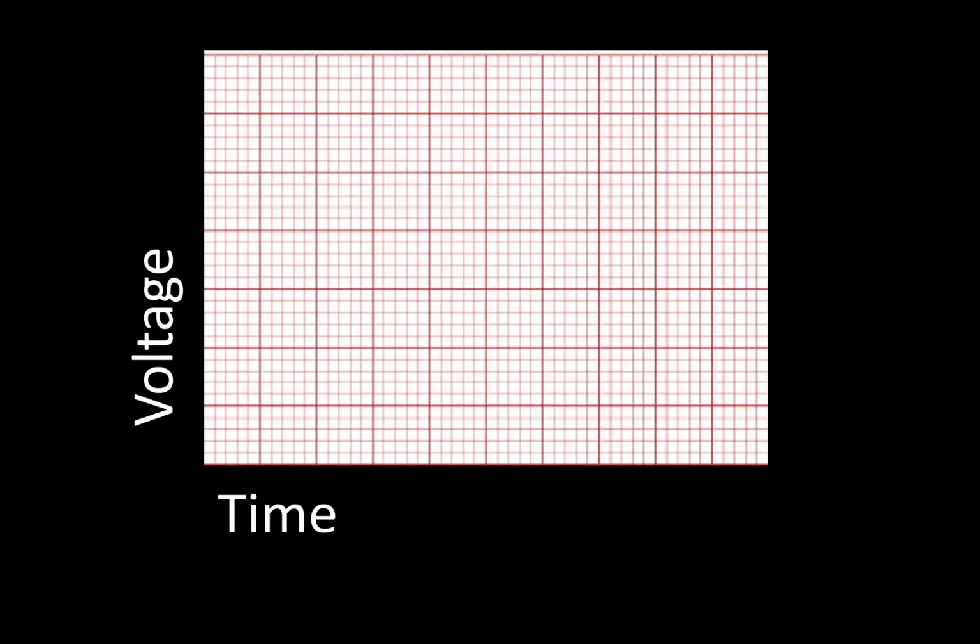All right, so this is a basic EKG grid, EKG paper. This is very, very standard. Pretty much all of them work exactly this way. And the idea is this. You have time along the bottom traveling this direction and voltage traveling up. So the time portion of it, each small box, we tend to measure this in seconds. And so each small box right here is worth 0.04 seconds. Now you'll see each small box is contained in a larger cube.